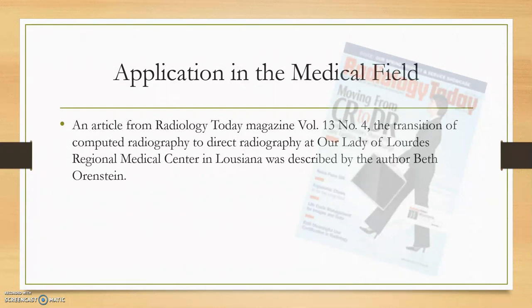So it seems that basically, as it was stated in the article, DR is superior to CR in almost every aspect, but many facilities will continue to offer a blend of both because it's just too expensive at times.